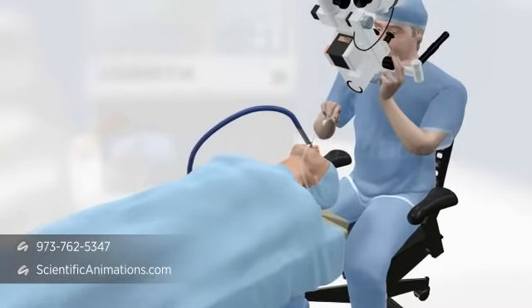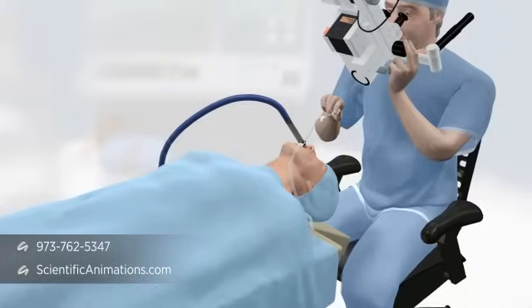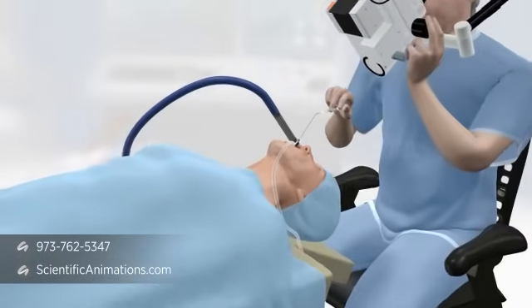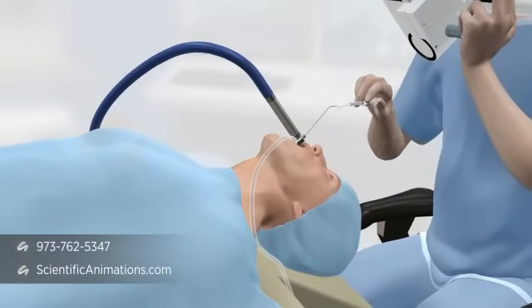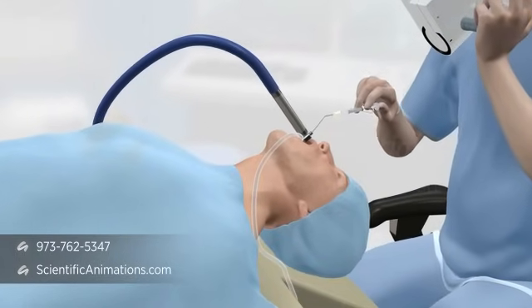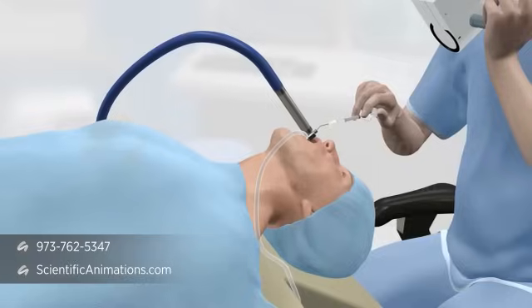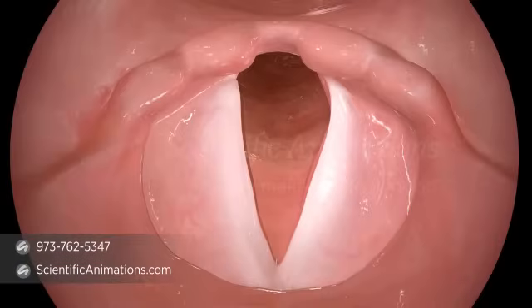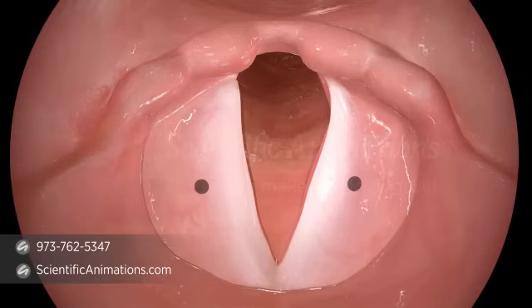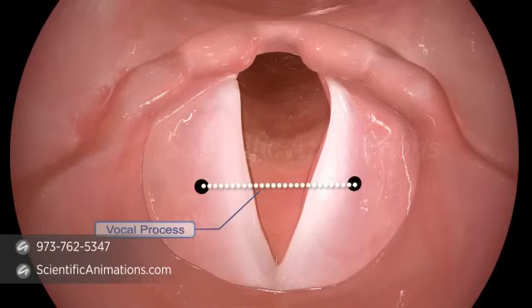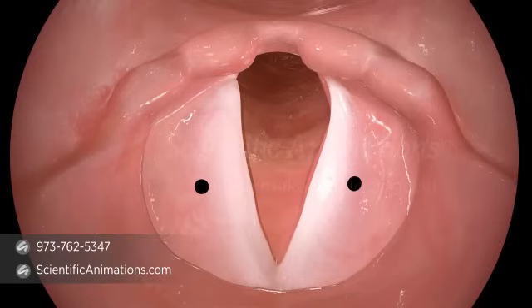Using either microscopic observation or telescopic observation, advance the needle through the laryngoscope. The ideal first injection site is at the level of the vocal process, lateral to or in the thyroarytenoid muscle at a depth of 5 to 7 millimeters.